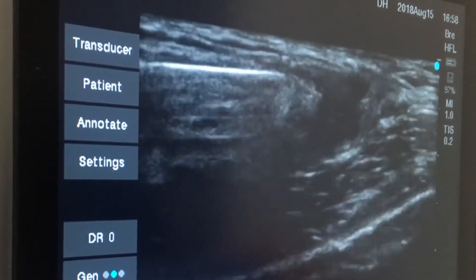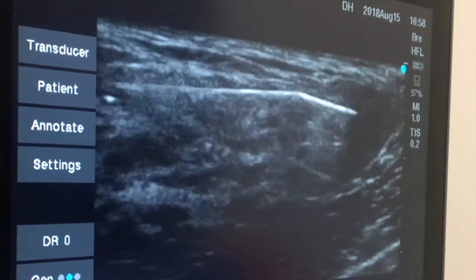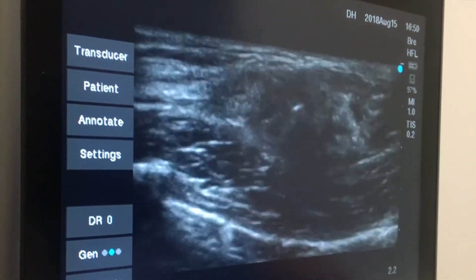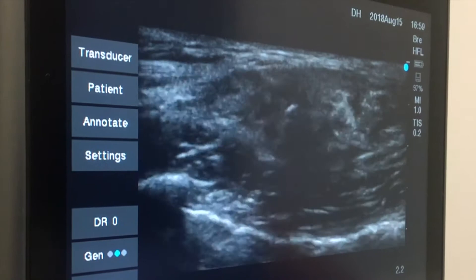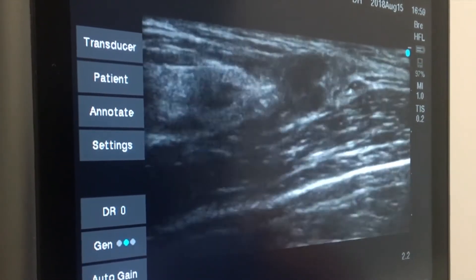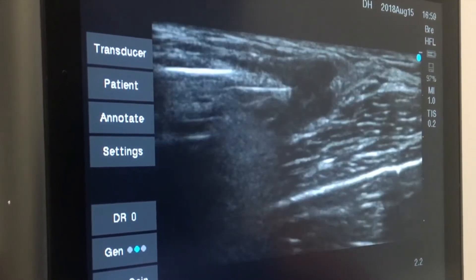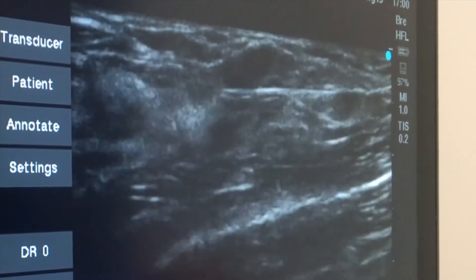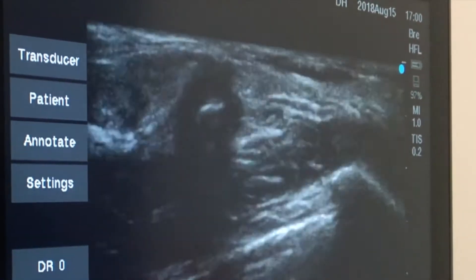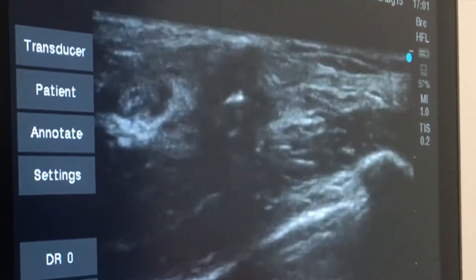Now you see the cryoprobe appearing as a white line entering the dark cancer from the left. From a different angle you can see the cryoprobe appearing as a white dot at the center of the cancer. Fast forwarding a bit, here you see the cryoprobe as a white line fully penetrating the dark cancer, and again from a different angle appearing as a white dot at the center of a dark cancer.